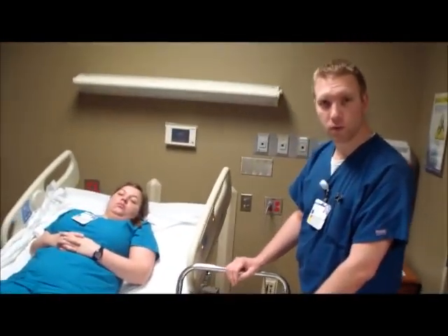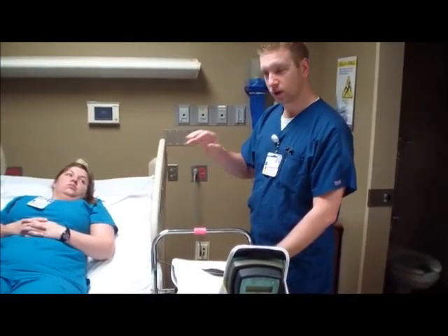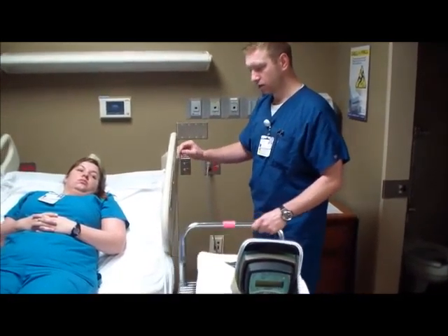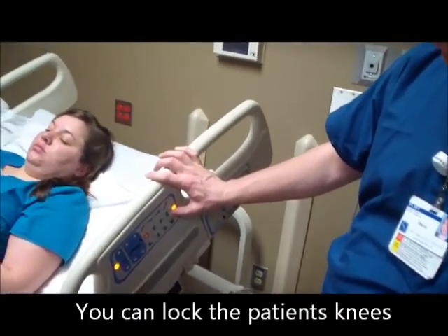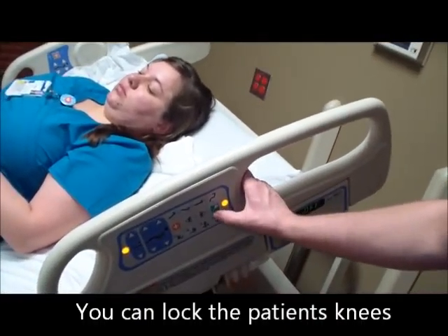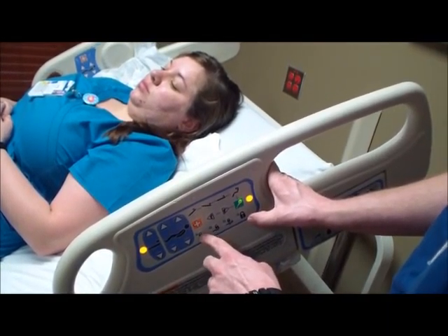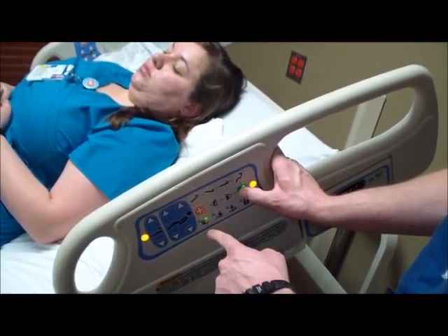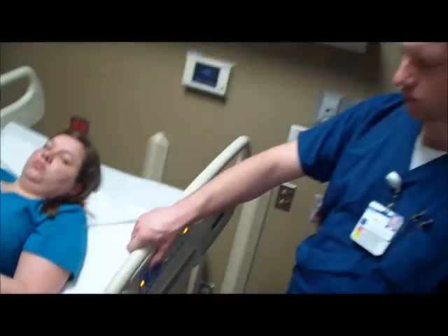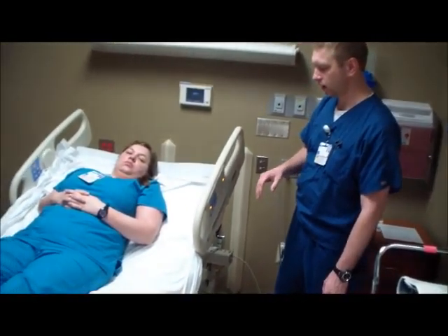And what you want to do as well, once you get it down all the way flat in the lower part of the bed, is make sure you lock that out. There's a little green button over here, which allows you to access all the other options on the bed. You want to push the green button, and that allows you to activate or adjust your different settings here. But what you want to do is hold the button and then make your selection. So now we can't move the knee part anywhere.